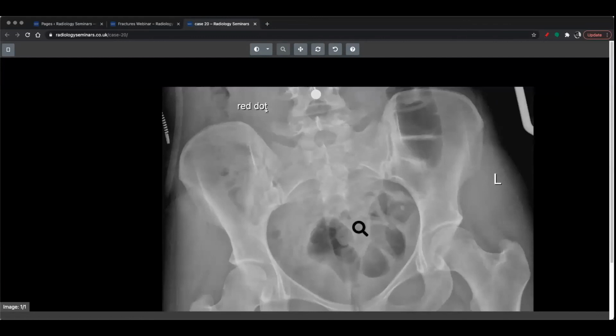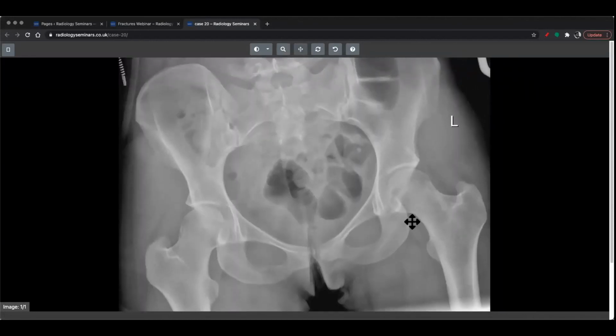So my big take-home points, hopefully, please explain the SCFE. Okay, so look, SCFE, do you mind just not abbreviating that? Maybe because I'm stressed in the situation of presenting, I'm not sure what you mean. But slipped, all right, so listen, on this one you're not going to get slipped upper femoral epiphysis. The reason is that you don't have growth plates. You need a growth plate to have a slip. So you wouldn't see that because you can't see a growth plate sitting there, yeah?